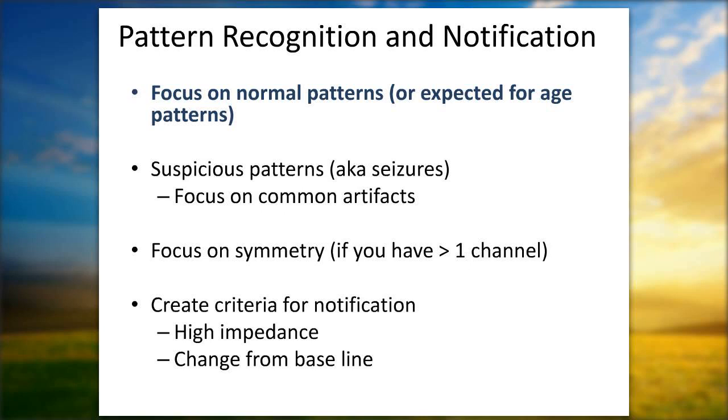And I think that there probably is some degree of that we see in cooling kids as well, really trying to draw that fine line between how low is low and how much higher is their high. And probably in cooling, we see a split similar to prematurity, probably some acuity. We probably do see some differences. But I think primarily its usefulness has been mostly looked at for preterm babies.